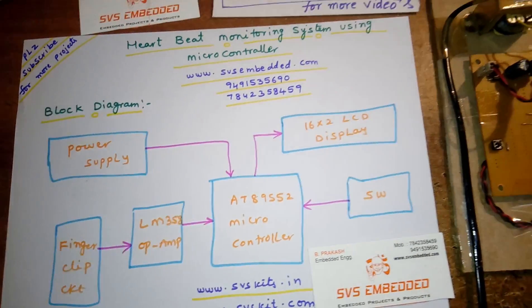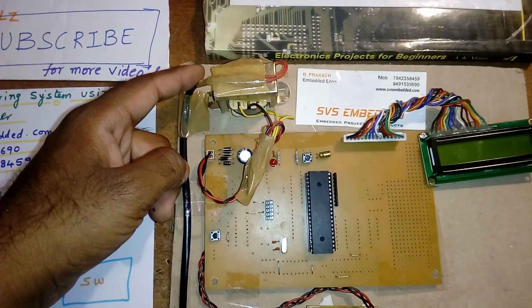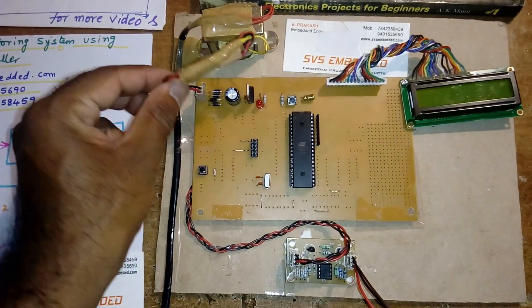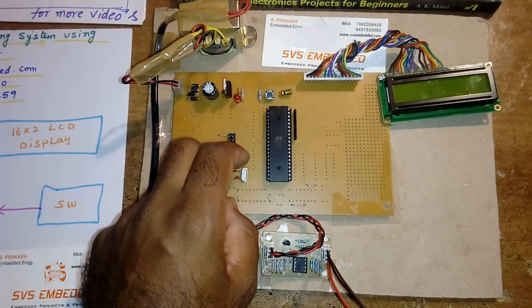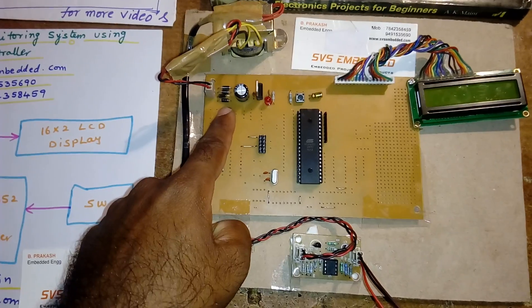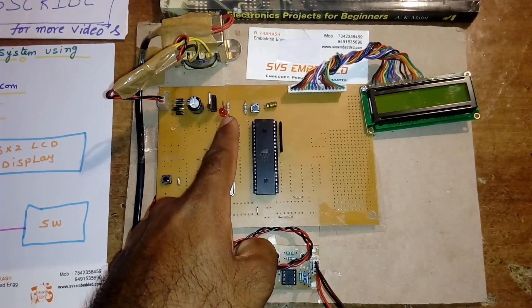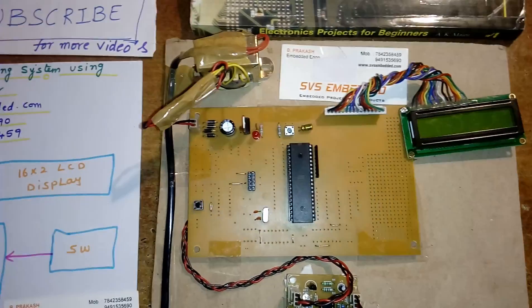Now let's look at the hardware part. Here I am using a 230V input step-down transformer with 9V AC output. It is given to a bridge rectifier, filter capacitor, 7805 regulator, and LED. I am using a 1000 microfarad 25V electrolytic capacitor and one 7805 regulator. This entire section is called the power supply section.